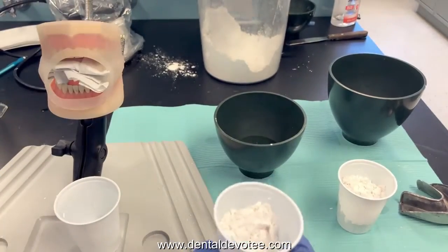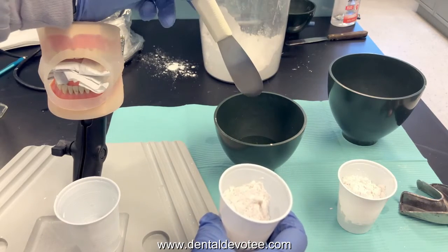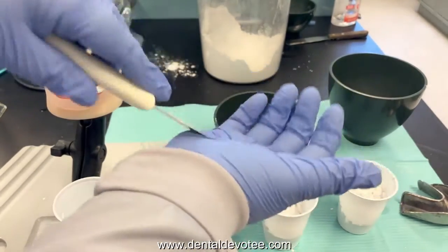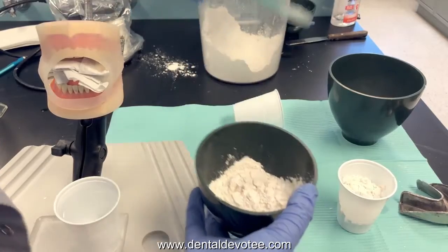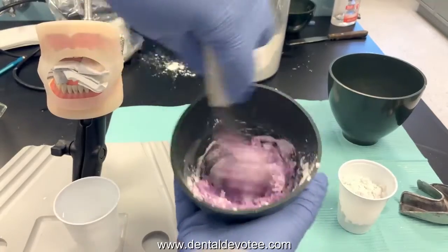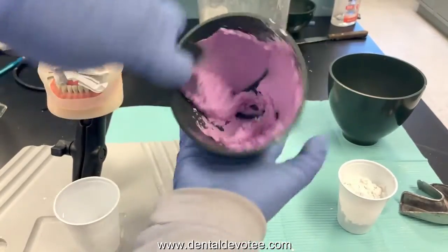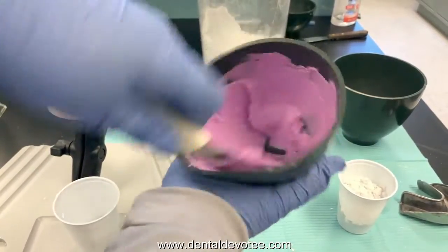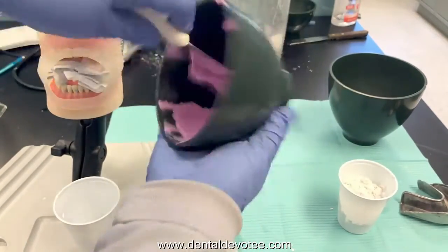The mixing technique: once you add your powder to the water — always add powder to water — stir to incorporate the powder, then stir very vigorously by pressing the spatula against the wall of the bowl. Powder goes into the water; stir it so all the powder gets wet. Chromaclone is great because it changes colors — it starts out really dark pink and then gets lighter. Once it's all wetted, turn the bowl and press the spatula firmly against the sides, rotating and pressing, wiping the spatula on the sides of the bowl. That happens really fast.